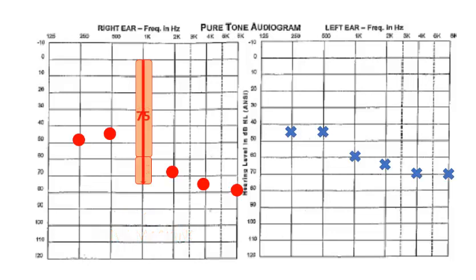Now, with 75 dB effective masking introduced into the right ear, the threshold of the tone increases up to 75 dB HL. At this level, it's detectable 50% of the time. But we could say that of the 75 dB of effective masking delivered to the ear, 60 dB was a compensation amount to accommodate for the hearing level, while 15 dB was the actual active masking.